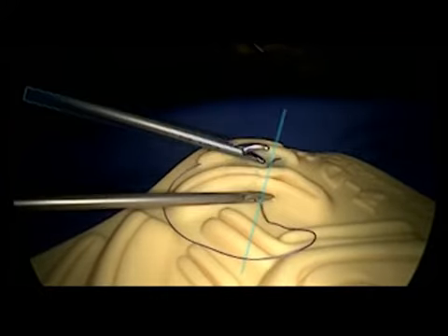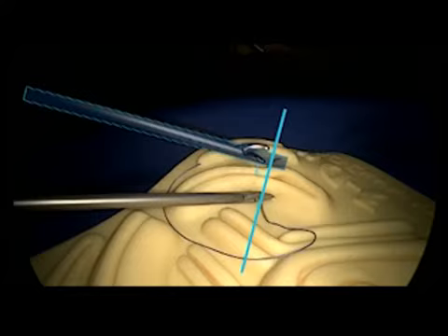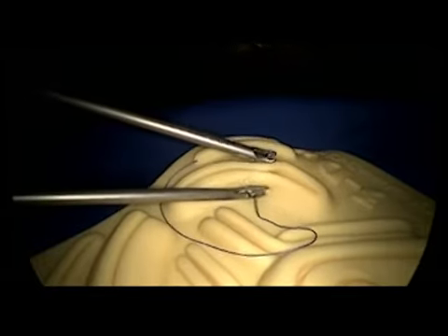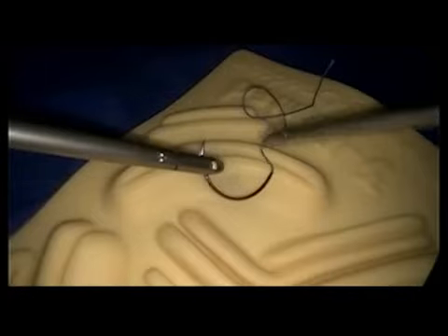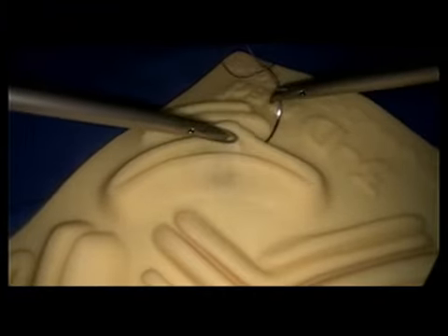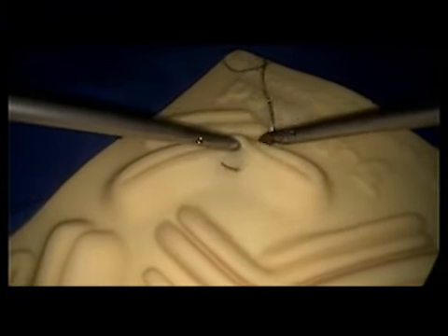The needle is rotated through the tissue until the assistant grasper is perpendicular to the curve of the needle. The needle is grasped at point B, rotated through the tissue. The alteration of the tissue plane's visual angle by motion aids in determining the entrance and exit points of the needle through the tissue.